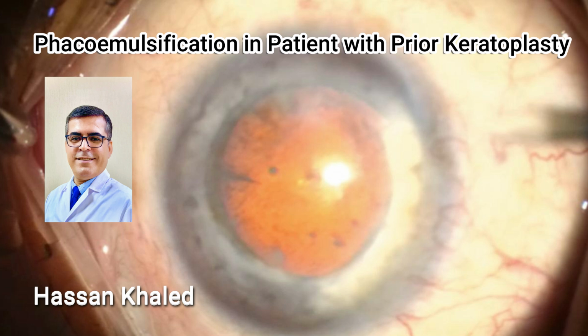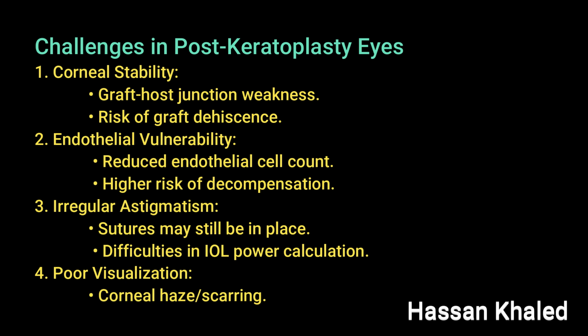Phacoemulsification in patients with a prior keratoplasty. Challenges in post-keratoplasty eyes include corneal stability and the endothelial cell count, together with irregular astigmatism and poor visualization due to corneal haze and scarring.